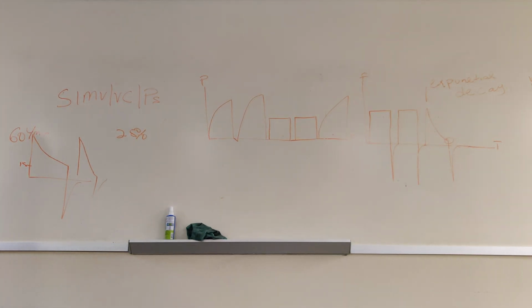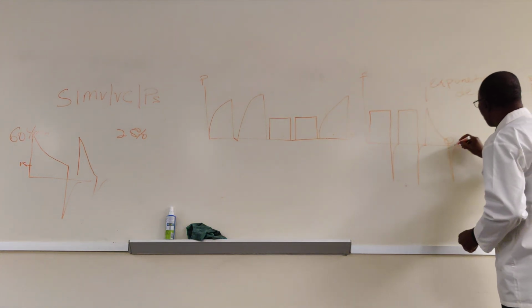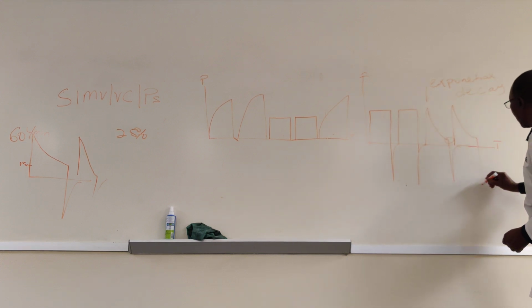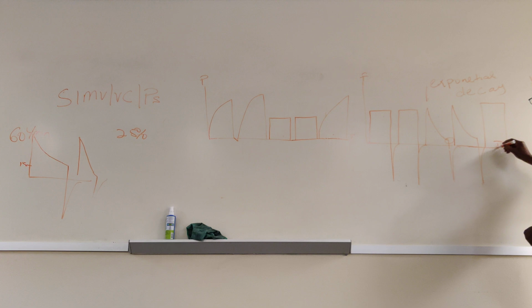It is flow cycled. Okay, because flow is what gets it out of inspiration. Okay? All right, so right here, there's another pressure supported breath. Exponential decay. Right here, my expiratory sensitivity will cycle off here. And then I have my machine breath, which is going to look like that. Okay? So that's the flow time curve.